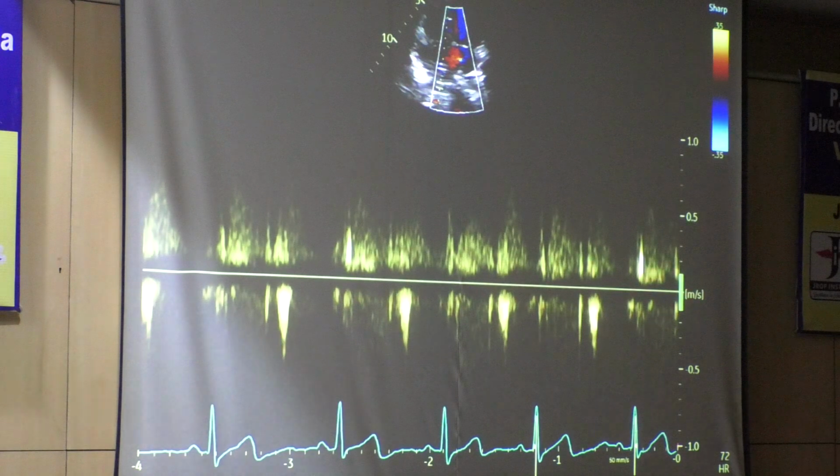Second thing, a number of times I have noticed the pulmonic venous flow velocity is almost 30 to 40 centimeters per second. Sometimes it's very high, close to 1 meter per second. That is pulmonic venous obstruction leading to elevated RV and RA pressures. So here itself we'll know that something is wrong with the child.